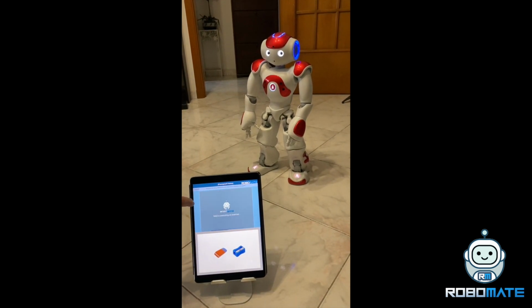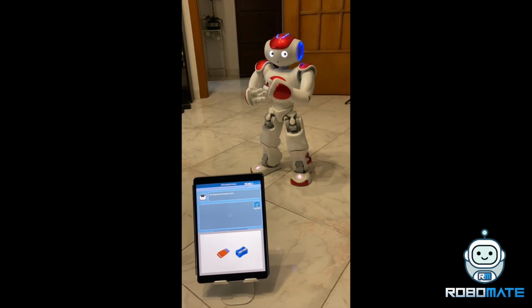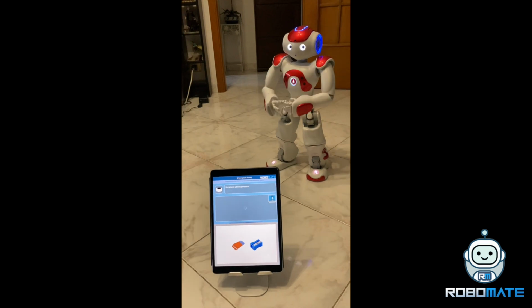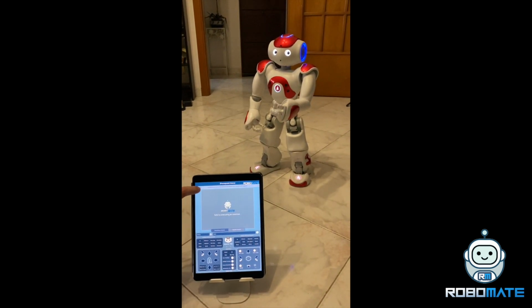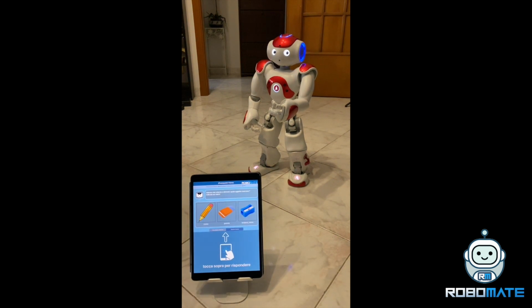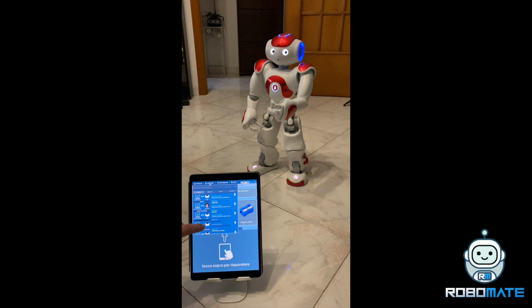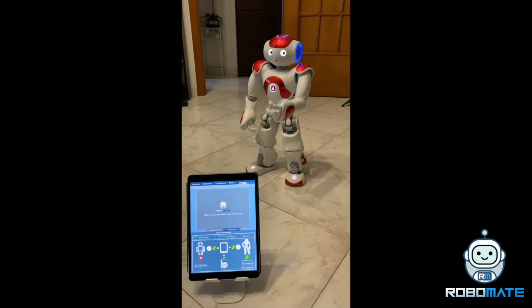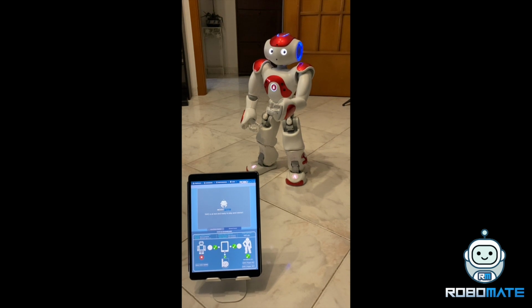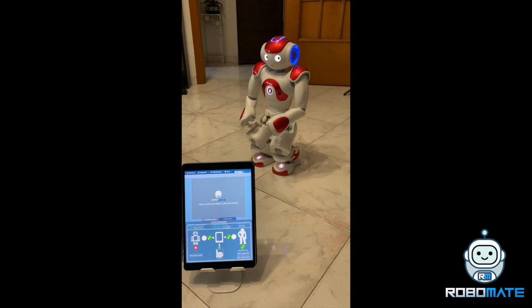Adesso stai attento e dimmi quale oggetto mancava? Indicalo sul tablet. The remote control is always available during the exercise. Okay, let's stop the exercise. Now it's going to stop the exercise and move to a safe position.